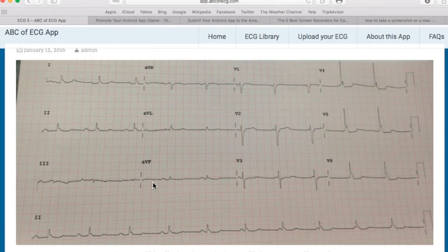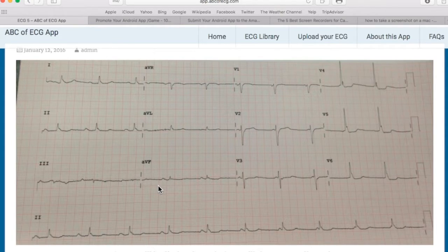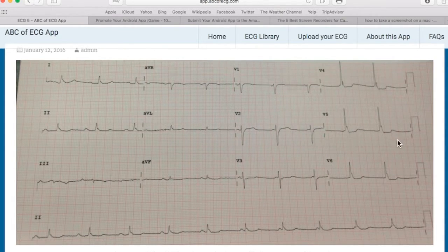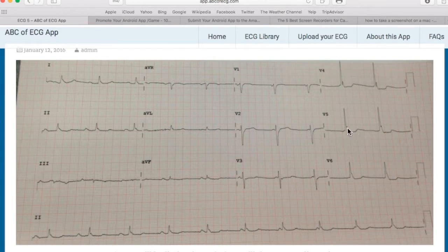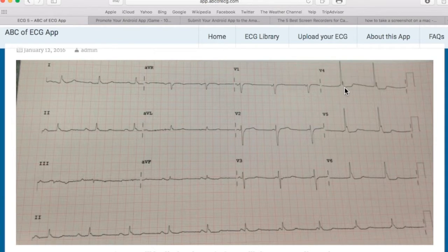Looking at this ECG for one instance, you might think that this is a completely normal ECG, except for the slurring of R waves which some might feel is abnormal. But let me tell you this is totally normal — it's called benign early repolarization.